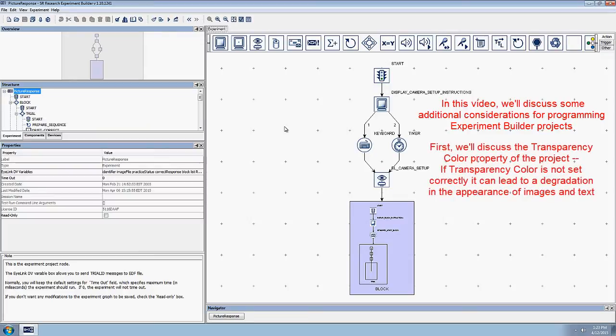First, we'll discuss how to set the transparency color property, which can lead to image and text degradation if not properly set.